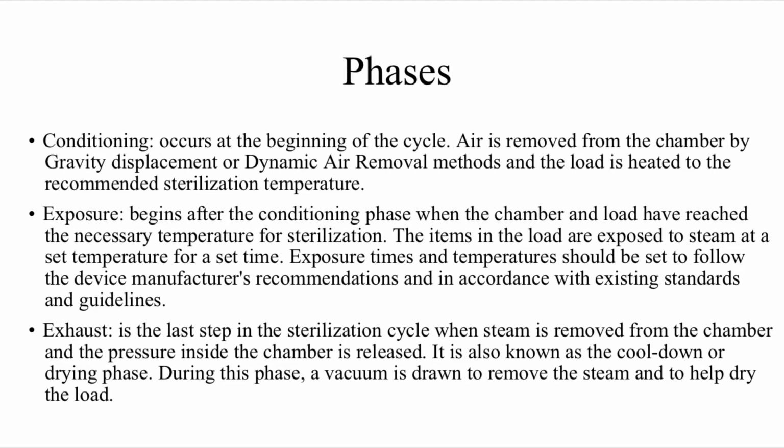Phases. Conditioning occurs at the beginning of the cycle. Air is removed from the chamber by gravity displacement or dynamic air removal methods, and the load is heated to the recommended sterilization temperature.